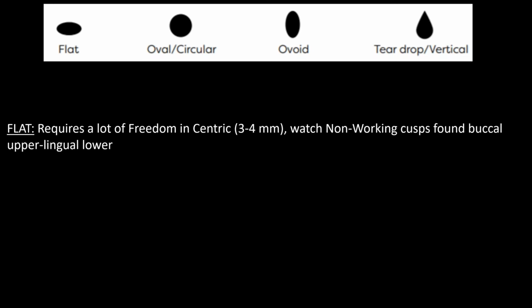So hence the comment. It was interesting because I can tell you, my dear colleagues, all 141 of you now, darn it, I would have a patient come in, this was during the first 5 years of my career, and the teeth were all worn down. So I took new impressions and took the bite and set everything up, and the patient comes back and goes, it's loose, it's loose. I'd remount it, put it back on the articulator. Please, my Centric's right, working and balancing's all good.